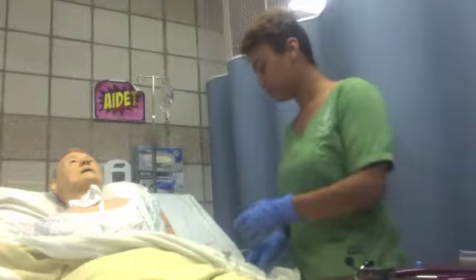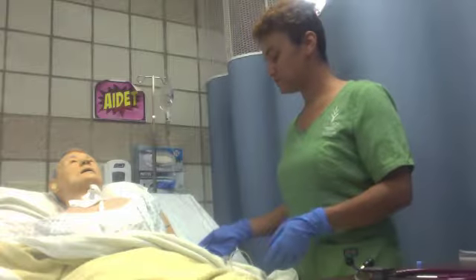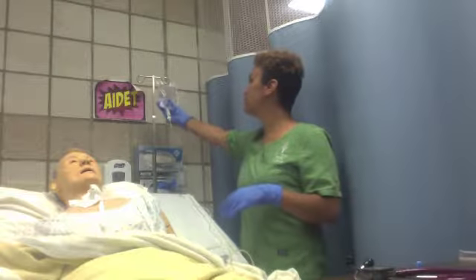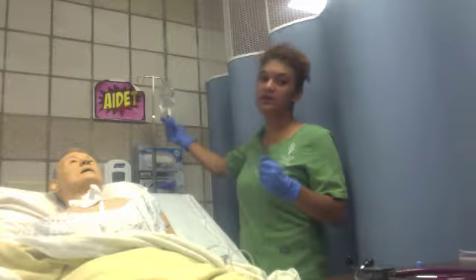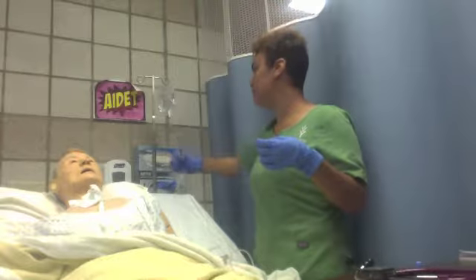All right. So I'm looking at the site here, but first I'm going to check this. I'm going to look at the bag. I'm going to look for the color, the clarity of it, any leakage, any expiration dates. I'm looking for the drip rate. If it's just a drip and it's a gravity flow, I'm looking at the drip rate.